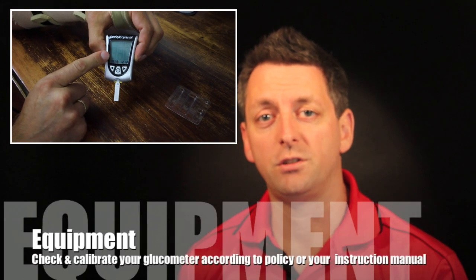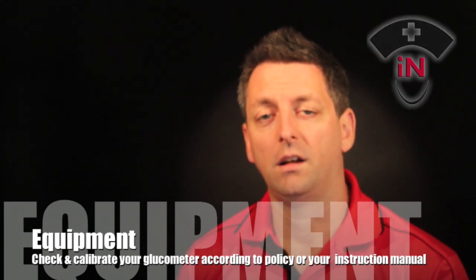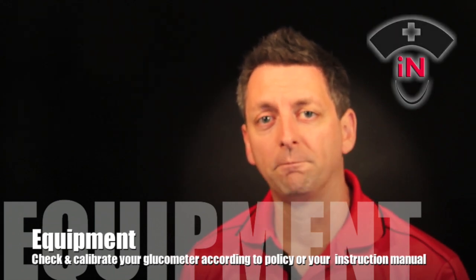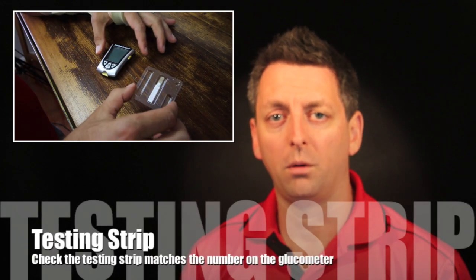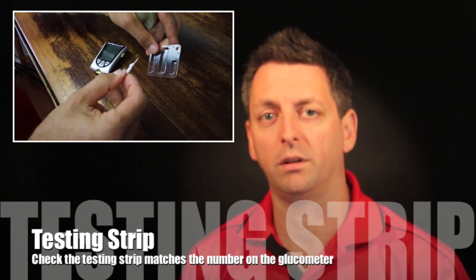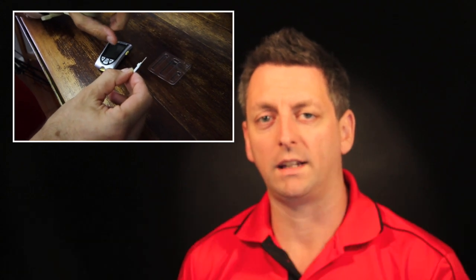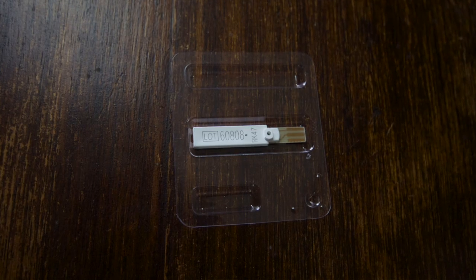Firstly we need to get our equipment prepared properly. We're going to make sure our glucometer is checked and calibrated correctly — that's usually done as per local policy. Check that the glucose testing strip matches the same number that's on your glucometer so that they correspond. If they don't, you need to recalibrate your sample sticks with your glucometer.